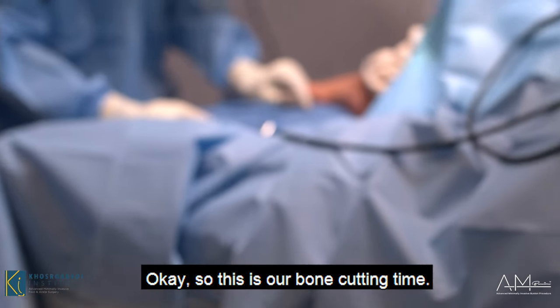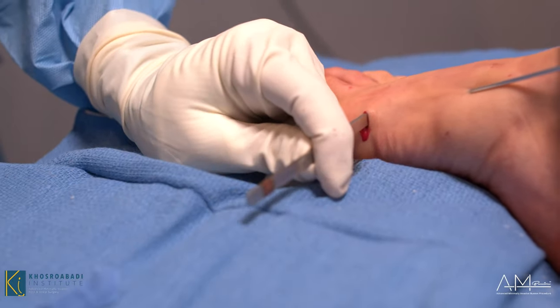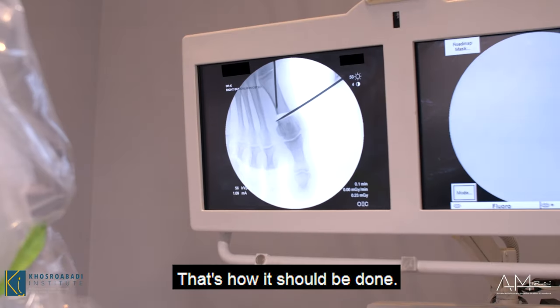We're at the bone cutting stage — that took us a couple of minutes to get here. Very nice and clean cut — that's how it should be done.